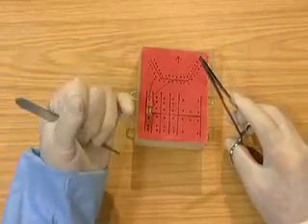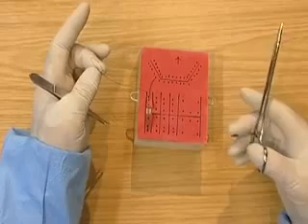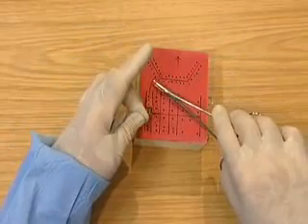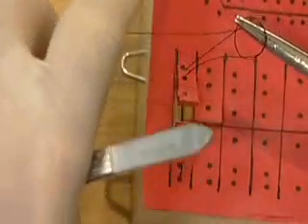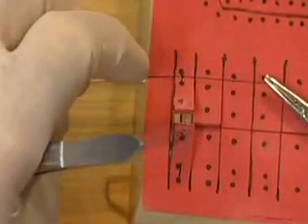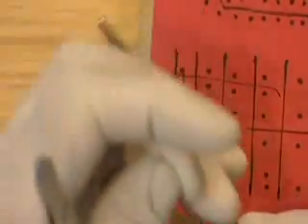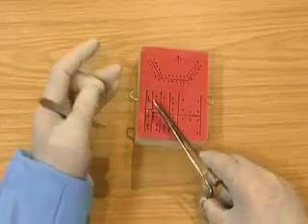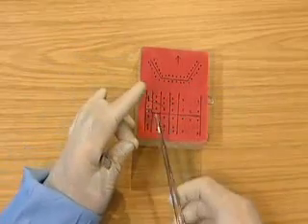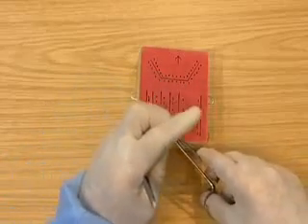Part the tissue pickups and pass the needle to the thumb and second finger. Go over and over. Pick up the end of the suture and wind the suture onto the third and fourth fingers. Tighten the knot with the first finger. Go under once. Pick up the end of the suture, pull the knot tight, and present the suture to be cut.